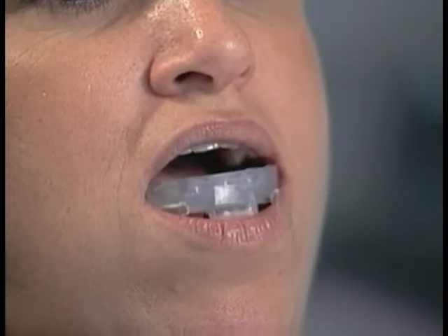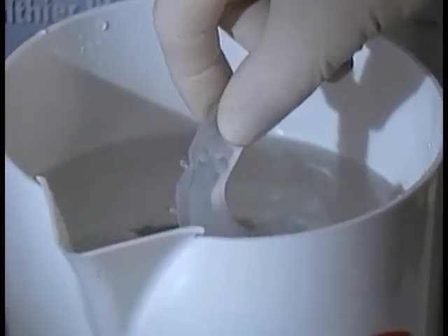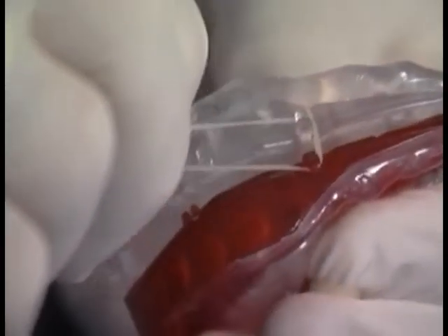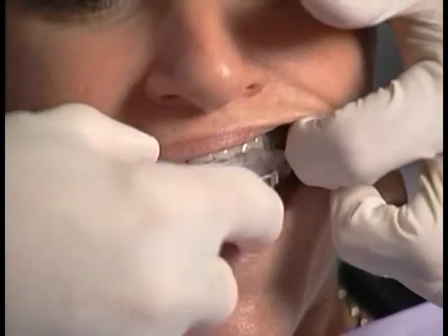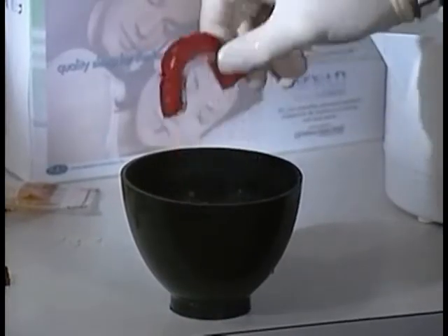If additional retention is needed, reheat only the affected component, this time for 90 to 120 seconds in boiling water, then reattach the elastics. Place the assembled device back in the mouth and have the patient bite down and suck in. Remove the device after 30 seconds, cool with water, and repeat the steps to increase retention.